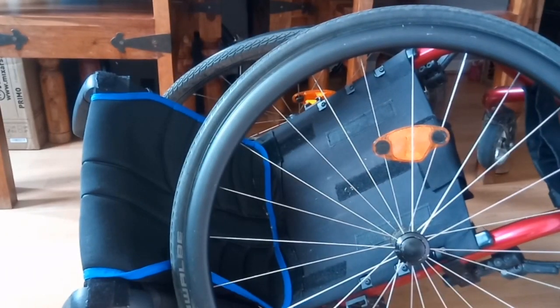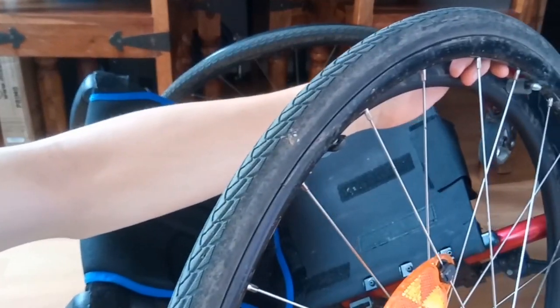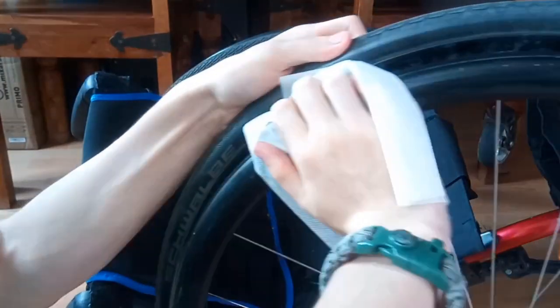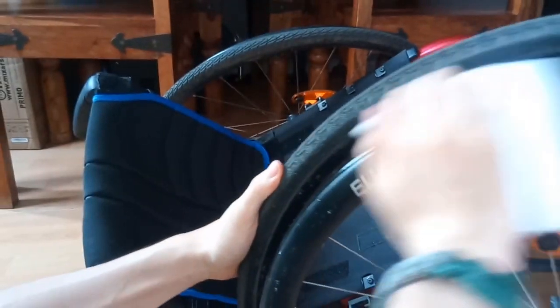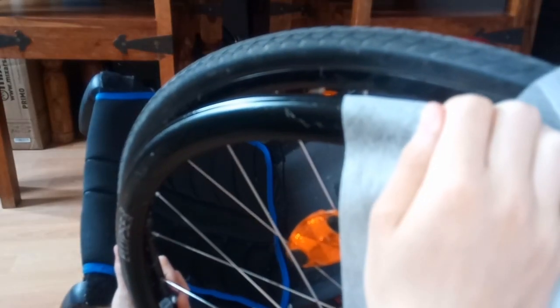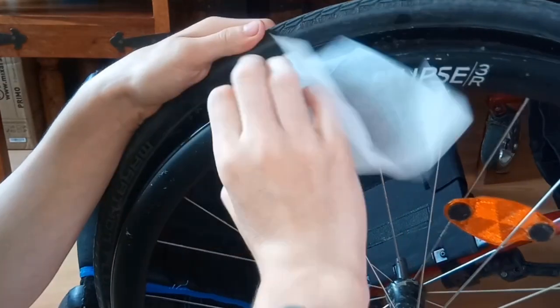I'll be getting one of these wipes, and what we're going to be doing is wiping down the wheel itself, so like this black bit, and then the tyre, because I might as well. But also the hand guards, or like the handles, I guess you could call them, because that's what I'm holding on to while pushing. So yeah, basically just wiping this bit off, you know, because why the hell not? Obviously a lot of this is just scratches that I probably won't be able to deal with, just looking at it. You know, as you can see there's just some scratches. It's not really dirt or anything.